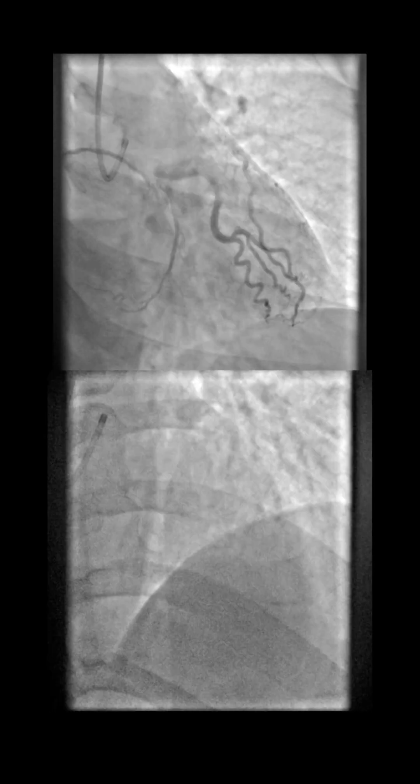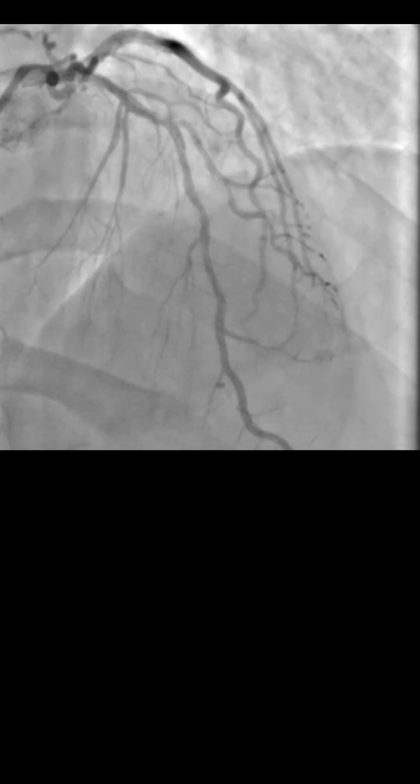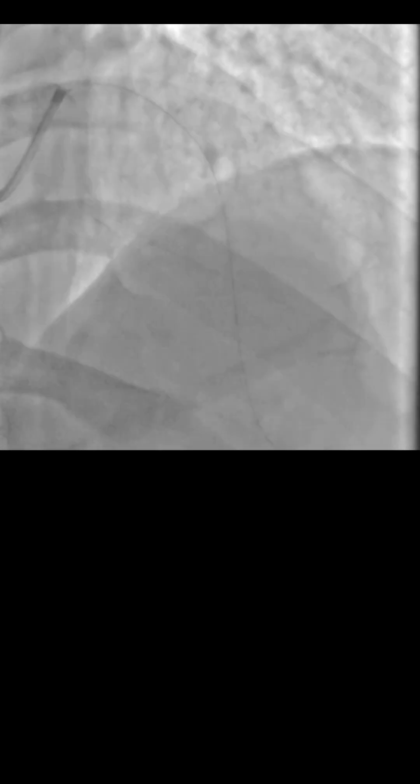Our algorithm is the same: we try to modify the lesion with a properly sized non-compliant balloon — 3.5 for the proximal LAD and 3.0 for the mid-LAD — and then we assess the result. The proximal LAD was fine, but we had an ugly-looking dissection in the mid-LAD.